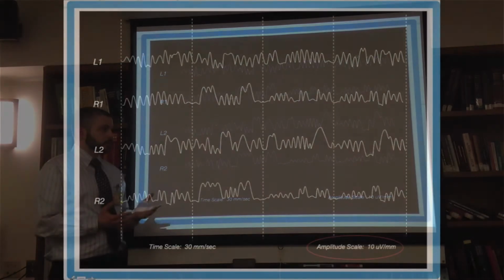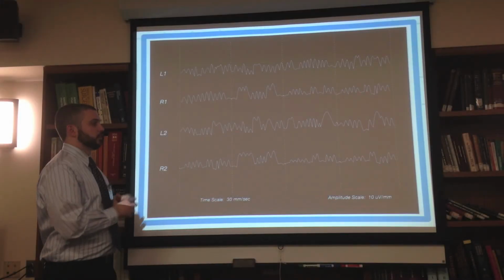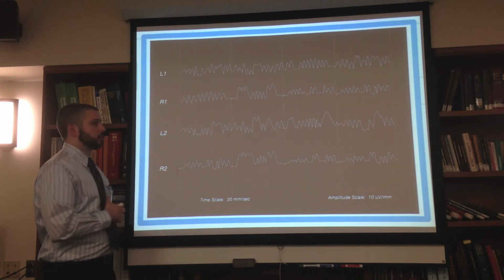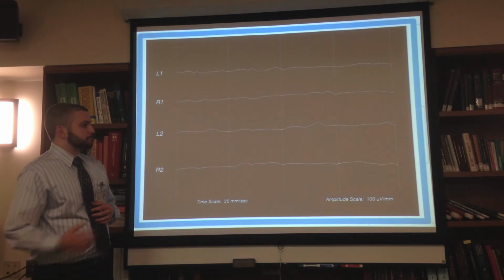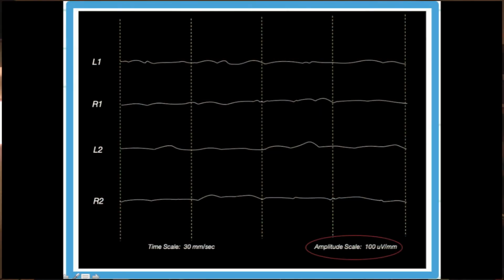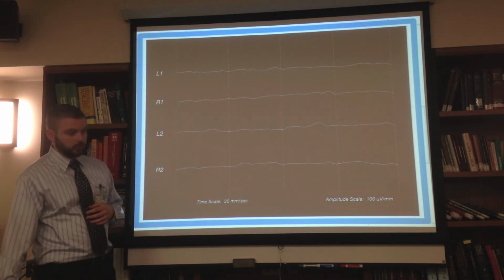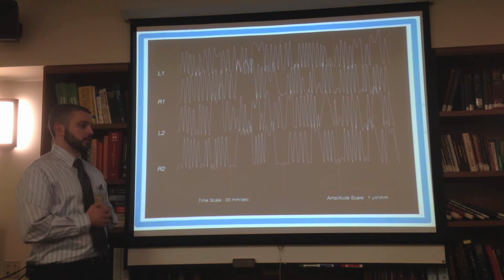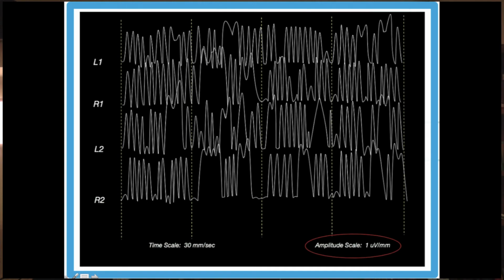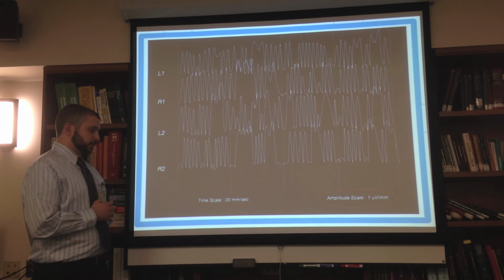As an example, in this EEG recording, we have a fictional scale set to 10 microvolts. And again, this gives our classic EEG waveform appearance that many of us are probably used to seeing. If we increase the amplitude to 100 microvolts, again, it gives off that isoelectric-like appearance. And if we were to decrease the amplitude to 1 microvolt, the voltage amplitude deflections recorded are much larger.